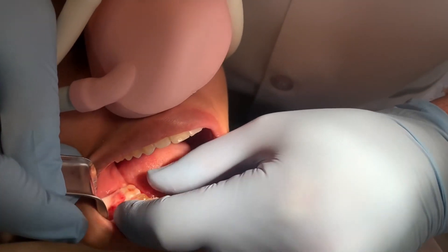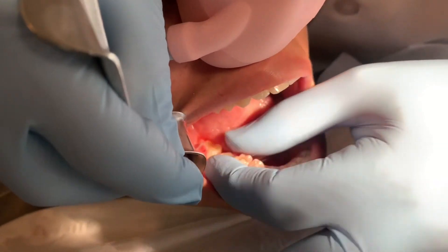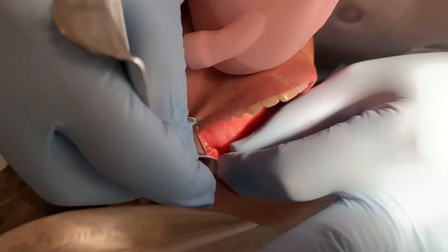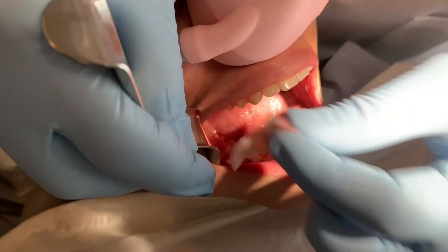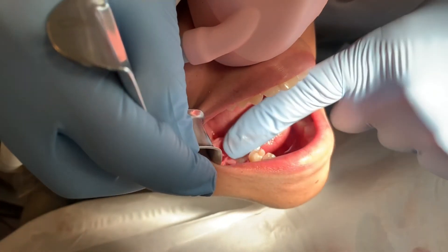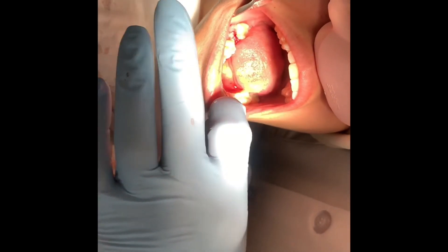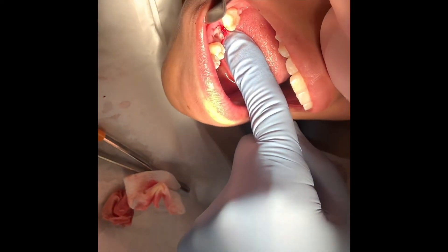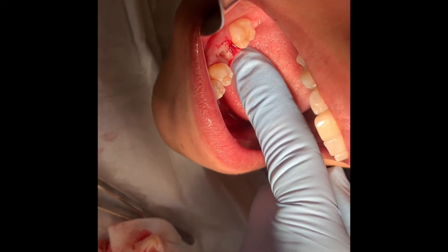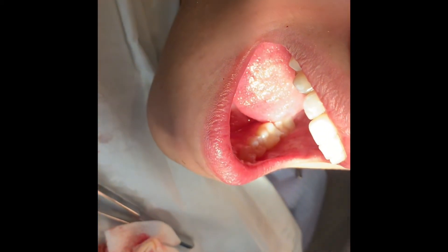We'll come over to our extraction site and put the platelet-rich fibrin in here. It looks very substantial — it's going to seem like it really isn't going to want to go in there, but I've trained my fingers to really get it going in the right direction. When you get it near in there, you can start pushing it in with a little bit of cotton. You'd be surprised how much this stuff will fit in here. This is what the site looks like once we have the fibrin in there — you can see the sites have totally filled with the fiber. All we have left to do is apply a couple of stitches.